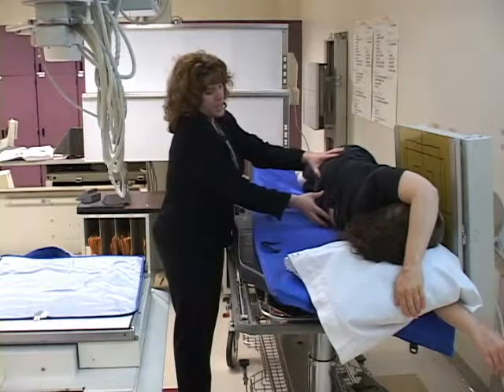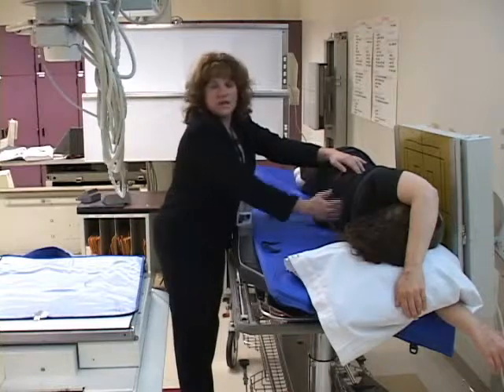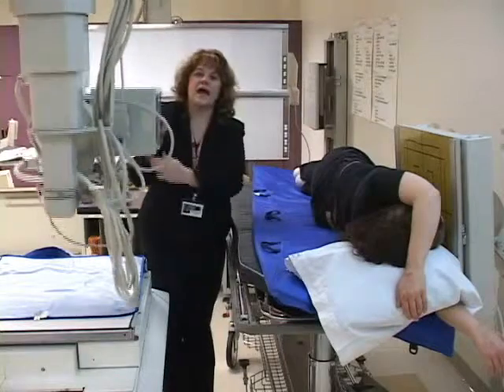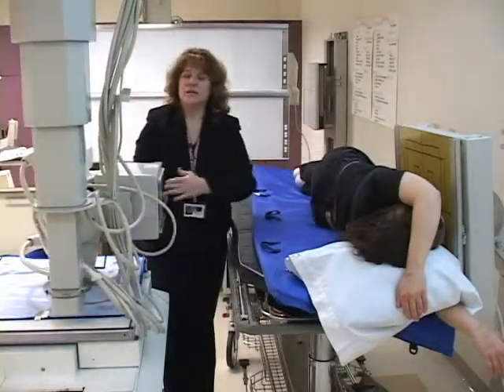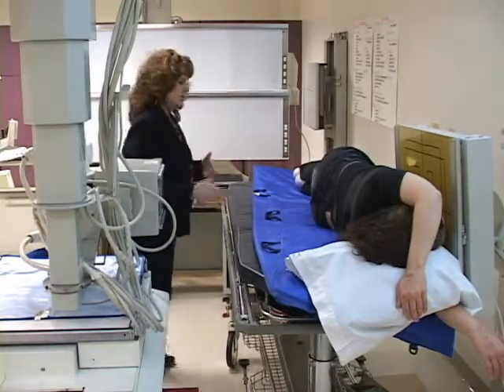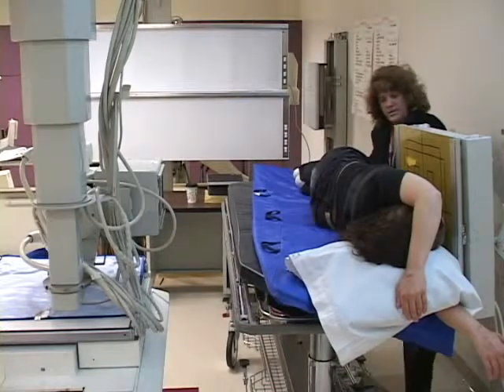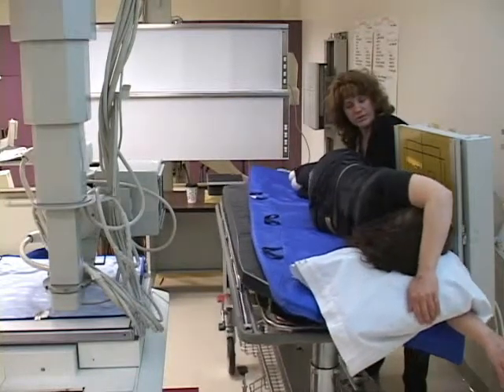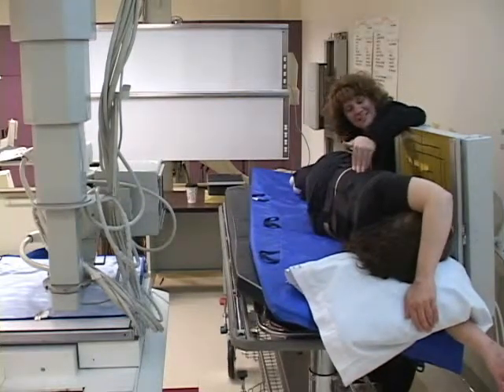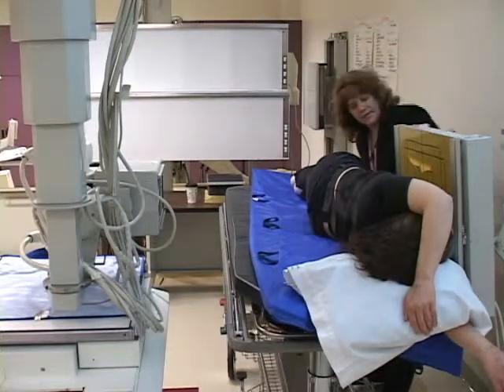Okay. And I'm going to have my central ray right at the level of the iliac crest. So I'll bring my tube head down. I'm going to have a 40-inch SID, so 40-inch right here. And now I'm going to start doing my tweaking. Okay, want to make sure that you lock the gurney after you've moved the patient. I'm looking for my central ray to enter right at the iliac crest. Okay. My tube is aligned to my wall bucky already.